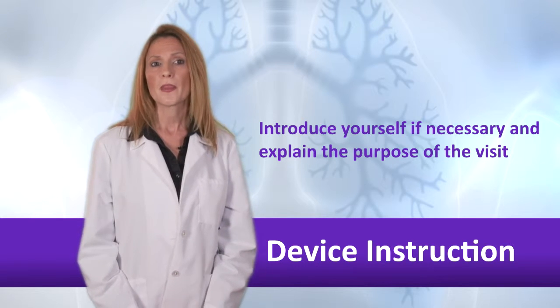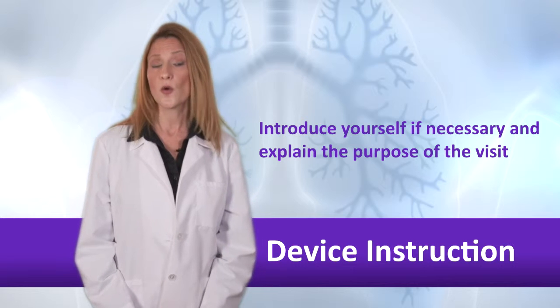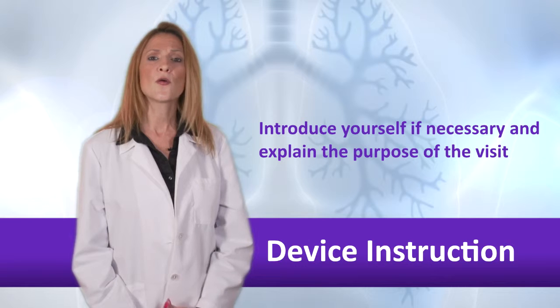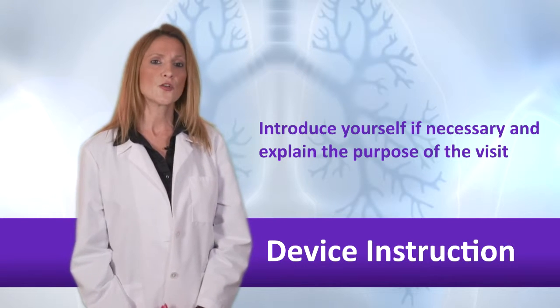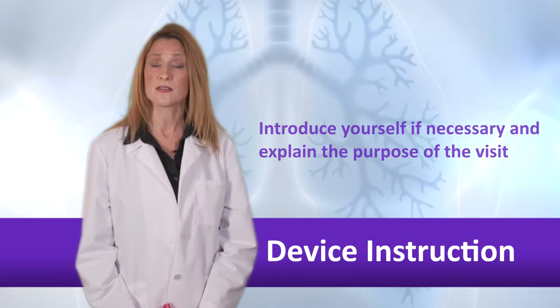For example, people don't get the full dose of medicine if they don't inhale it just right. Or, because inhaling medicine is a little tricky, we are going over this with all our patients. Or, I want to be sure you are getting the full benefit of your medicine, so you breathe your best.